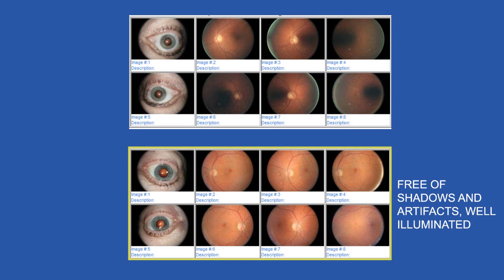We strongly encourage you to start dilating your patients, and a sample dilation protocol can be found in the photographer's manual at www.ipax.com. Please note, however, that because diagnostic pharmaceutical agents are being administered to the patient, each clinic must internally evaluate and approve their own dilation protocol.